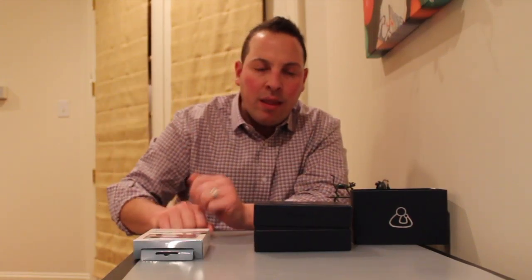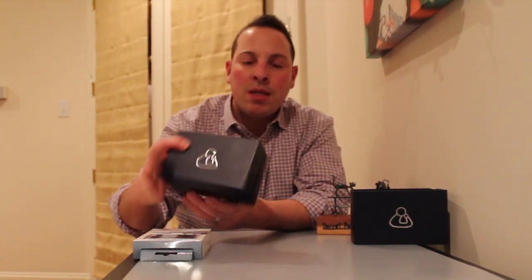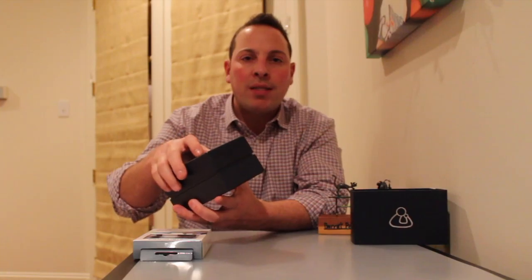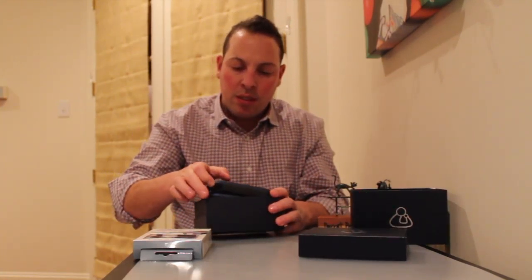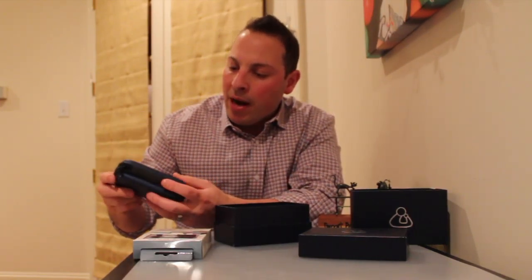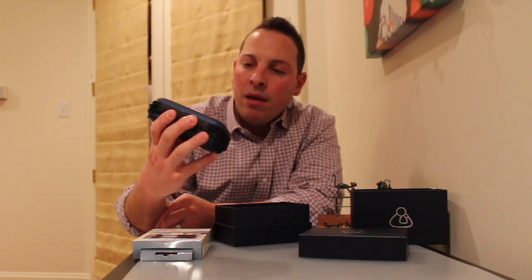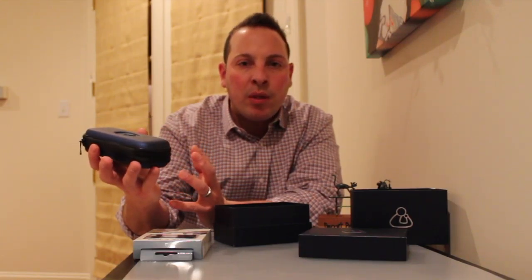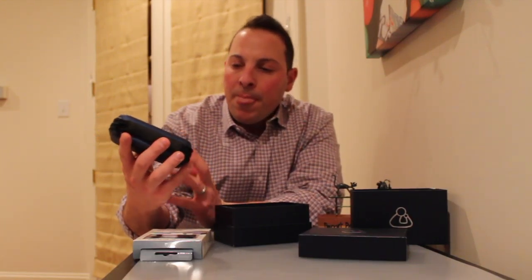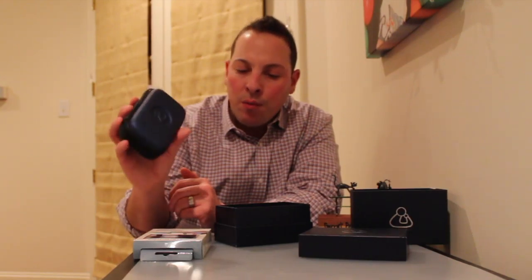We'll take a look at that maybe later once I get it all set up. And then we obviously have here what I hope is the stethoscope itself. In the box, it comes with a nice casing as you would expect, not too big as you can see. And quite honestly, I would expect it to be fairly nice considering the price tag for this is approximately $500 — about $200 more than the Welch Allen or other digital stethoscopes out there.